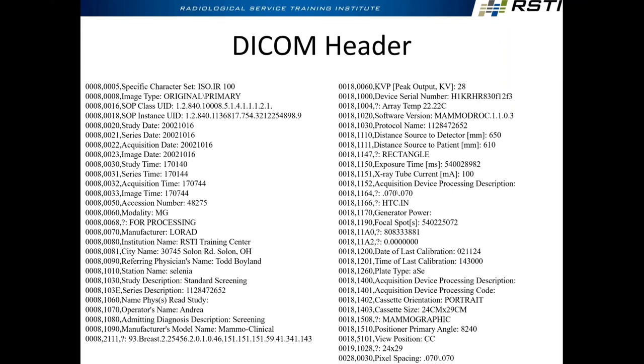This, I heard you guys mention before, something about DICOM header. This is the actual header data of a sample image. So every DICOM image has the actual picture, which is the image data and the pixel data, and then the DICOM header, which contains demographics, date, time, who, what, where, when. All that stuff is stored in every single image. Tons of it. That's quite big. Well, relative to the image, it's really small.